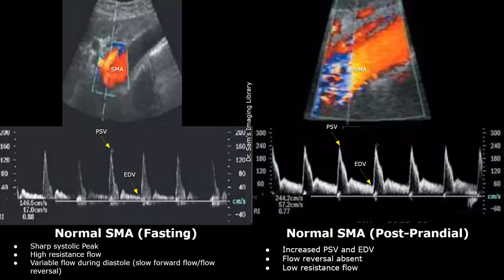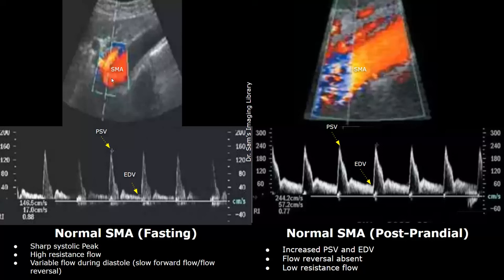Hello everyone, this is Dr. Sam. This video is about superior mesenteric artery Doppler ultrasound. These images show color and spectral Doppler analysis of the superior mesenteric artery during the fasting state and after eating.